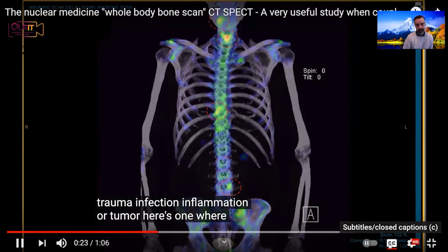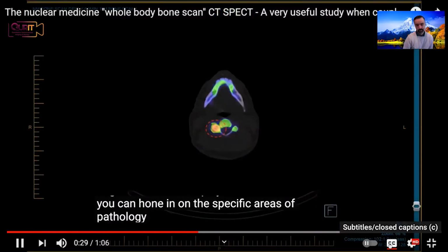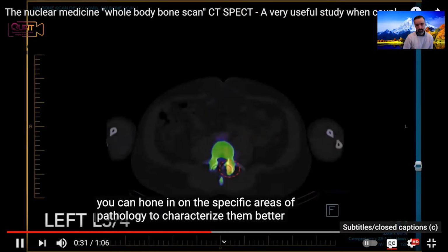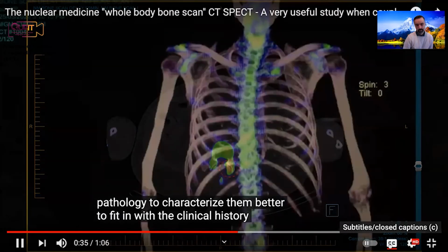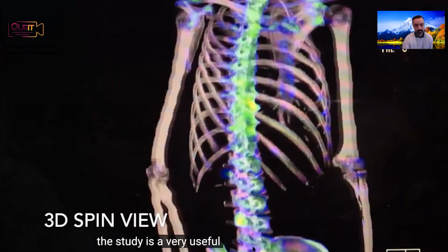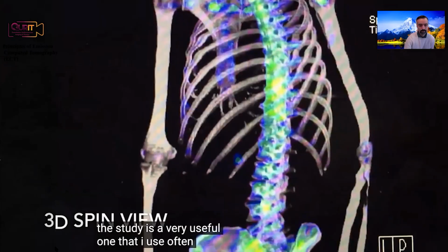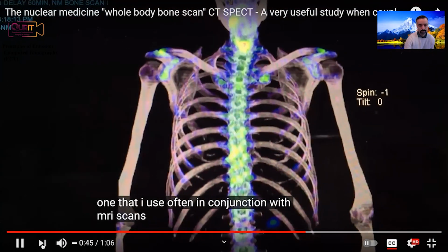Here's one where multifocal degeneration was at play. You can hone in on the specific areas of pathology to characterize them better, to fit in with the clinical history. The study is a very useful one that I use often in conjunction with MRI scans.